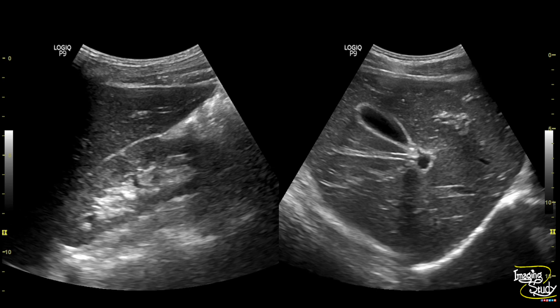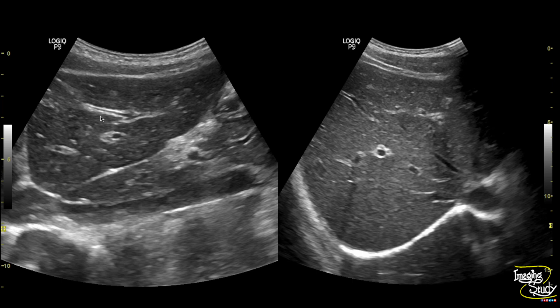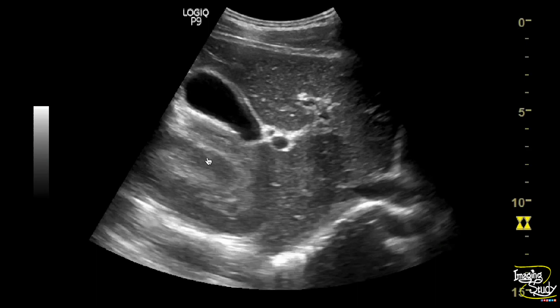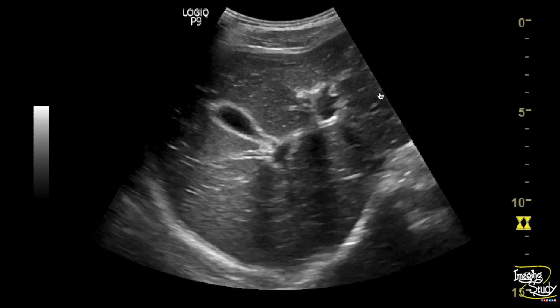Here is another picture showing the starry sky appearance with many portal veins within the hepatic parenchyma. The renal parenchymal echogenicity is increased in comparison to the hepatic one, and many portal veins are visible as tiny hyperechoic dots. On another image, the left lobe shows very prominent portal echoes. In real time you can also see many portal venous walls forming the starry sky appearance.